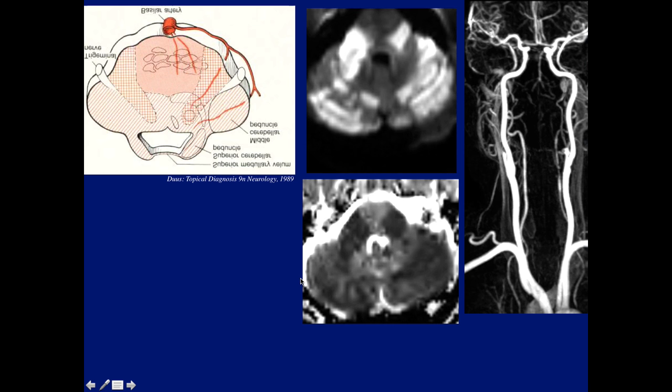Here's another stroke involving where the fibers from the trigeminal nerve will be coursing, in the territory of the short circumferential branches. This interesting case shows a patient with occlusion of both vertebral arteries, with strokes sparing the midline but involving the two lateral positions — the short circumferential territories were involved on both sides but the middle territory was spared.